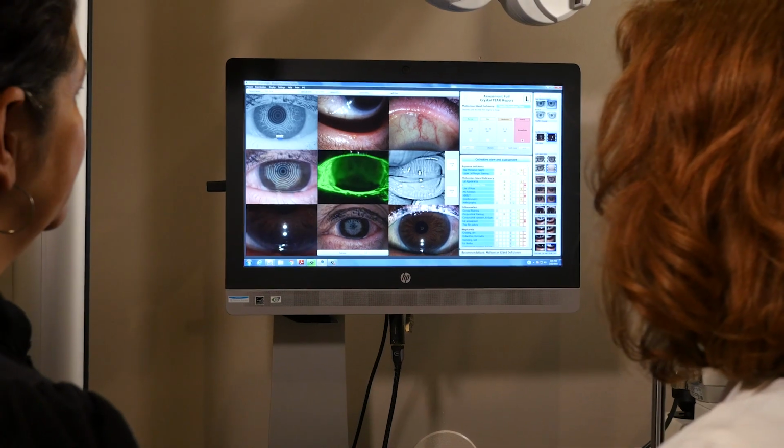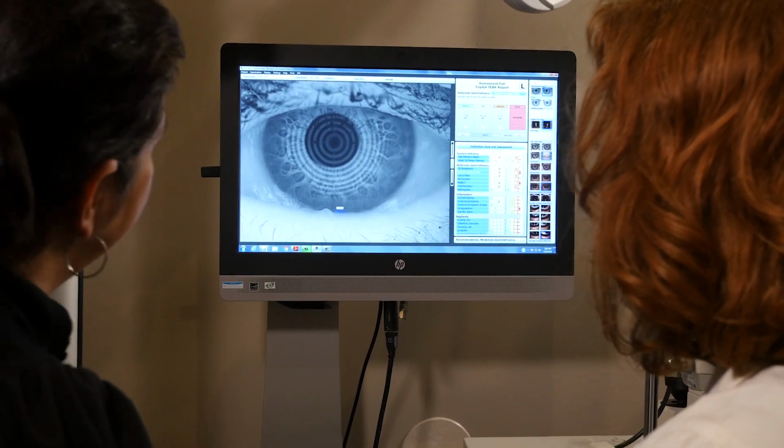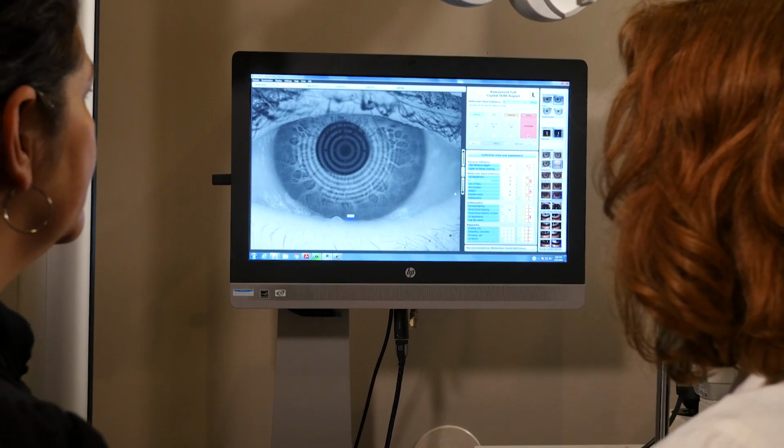And then comes the most important part of all. I pull up my 9-picture collage on the 5M, and this allows me to walk the patient through her story. I remind her of our goal for the day. It's to break down the underlying causes to her symptoms, and then I show her the water, the oil, the lack of color in the tear film, the quick breakup time, the partial blinks, her meibography, the debris in the tears, the redness, the staining.